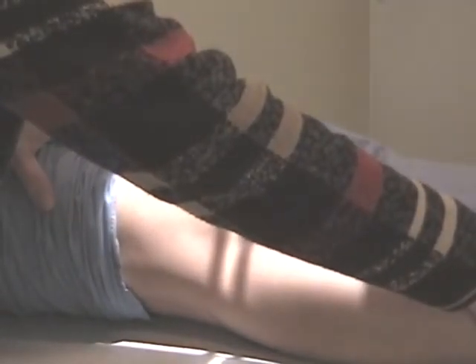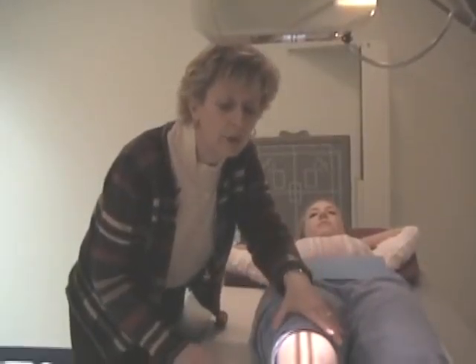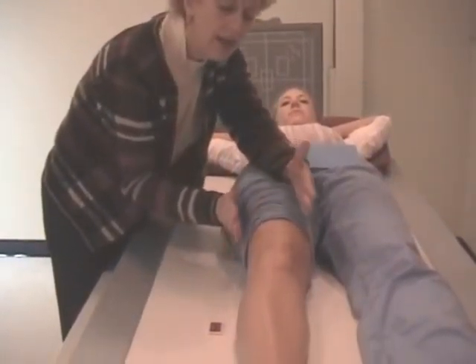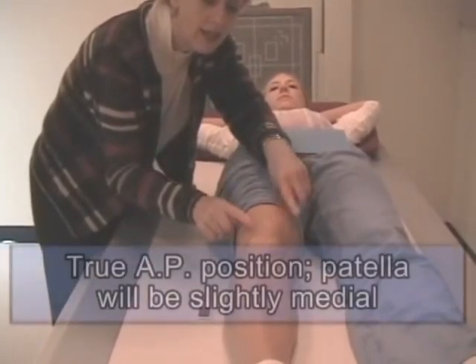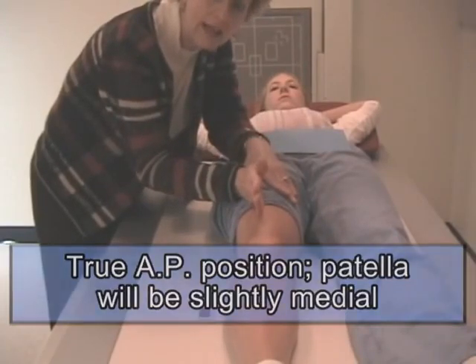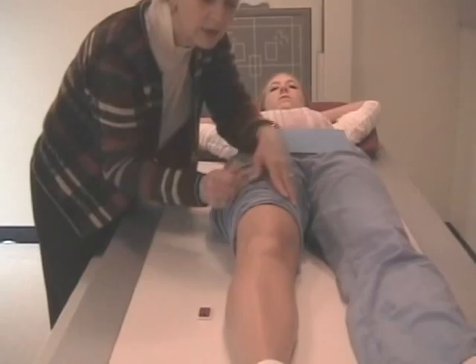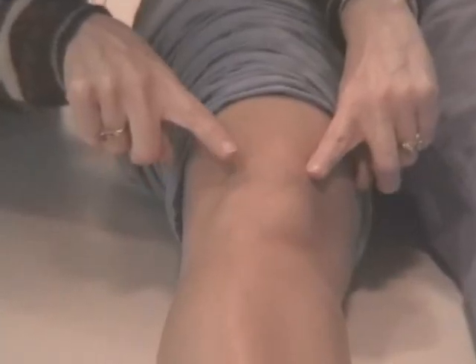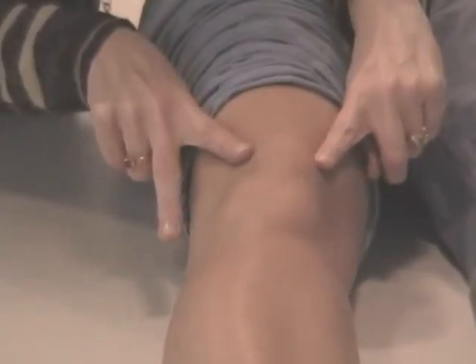Now we're going to roll the leg in just a little ways. The camera has realigned itself so you'll have a better look at the leg this way, because what I'm trying to show you is that if the leg is in a true AP position, the patella will lie slightly medial. It's not in the center of the leg, it's slightly off center towards the medial side. So you're going to look at the edges of the patella and evaluate the space from the edge of the patella to the side of the leg, edge of the patella to the side of the leg. Kristen actually has her leg too medial now.